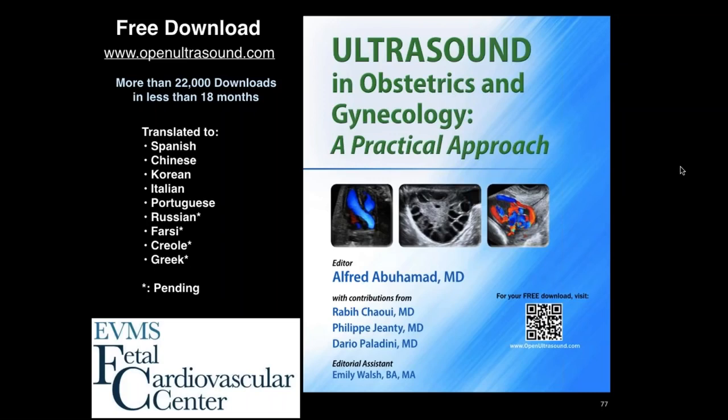But I could tell you that I'm hoping, and if you are on the webinar, certainly you're committed to and interested in ultrasound, we're going to be doing a lot more first trimester ultrasounds, I anticipate, in the next 5 to 10 years. And I anticipate that the first trimester ultrasound will play a much bigger role in our evaluation of the fetus, both from an anatomy point of view, but also from a functional and risk assessment point of view into the future.